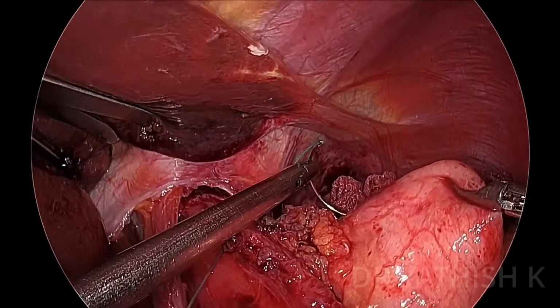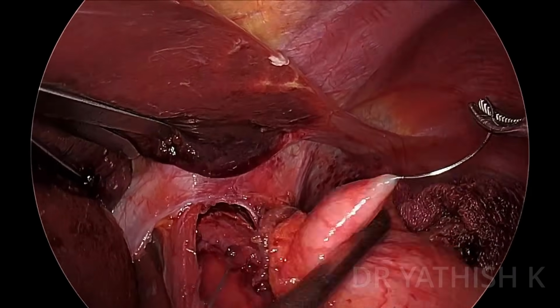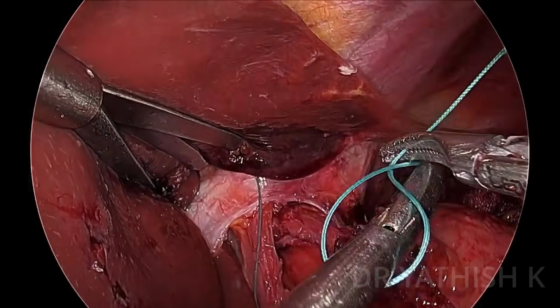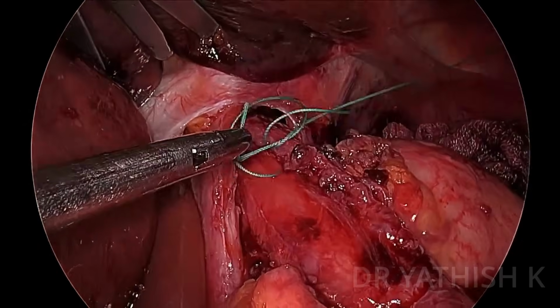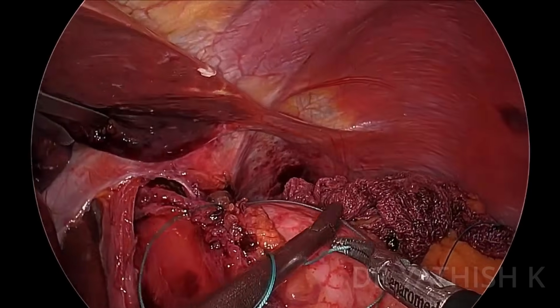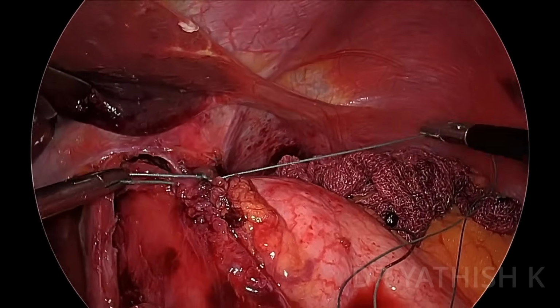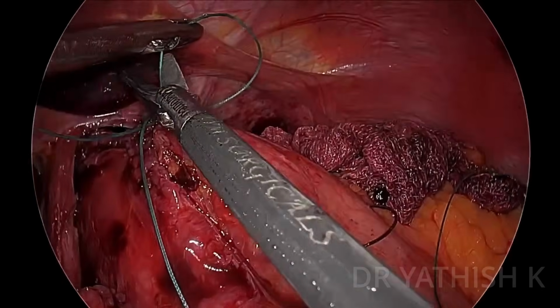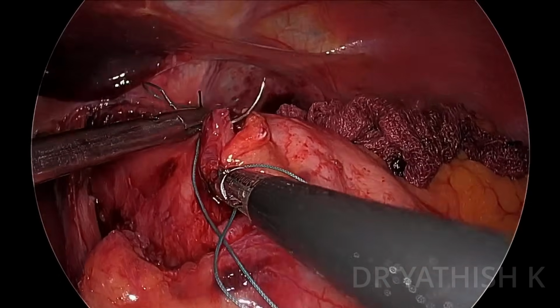The reason for adding a partial fundoplication is basically to reduce your postoperative GE reflux. Now that we have disrupted the lower esophageal sphincter, we have disrupted the musculature. There will always be a risk of reflux disease, right? So for that, you have to add a wrap component to prevent the reflux.